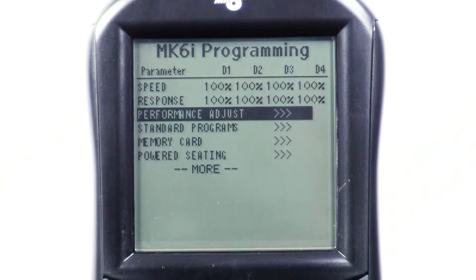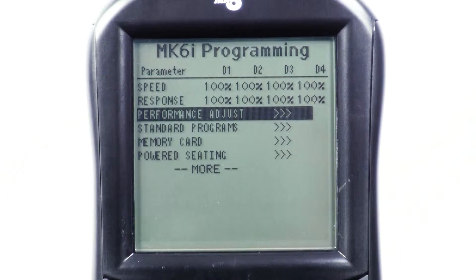The steps to turning G-Track on or off are simple and require your Mark VI handheld programmer. First, go to the Performance Adjustments menu and scroll down until you find G-Track.